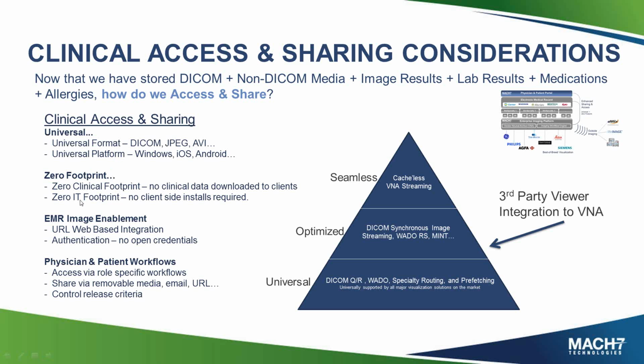From a zero footprint, there's also two flavors. Does that viewer have any clinical footprint? As you stream images, video files, or audio files, or whatever it may be to that viewer, does it have a clinical footprint? If my laptop were to crash and boot back up, is there going to be any image file on that laptop? You don't want that to happen. You want it to be a zero clinical footprint. Same thing from an IT footprint. Is there anything to install?